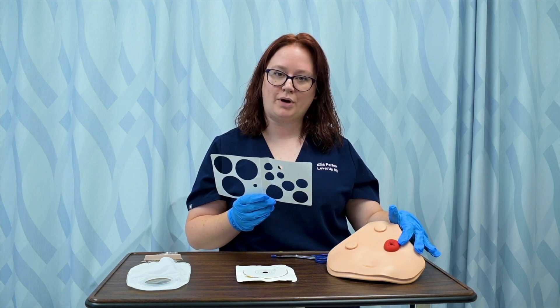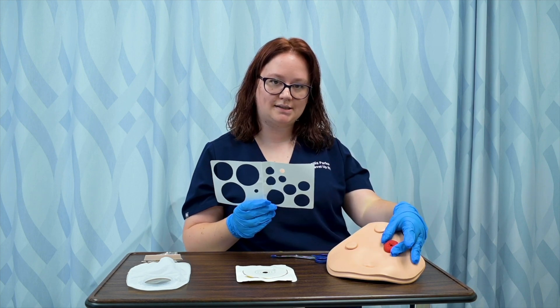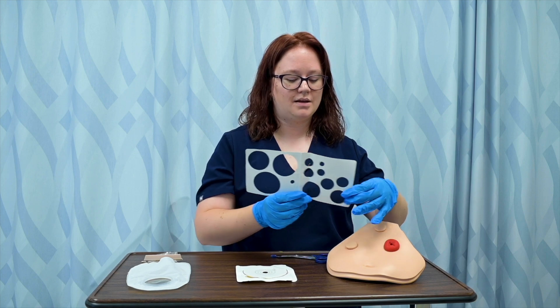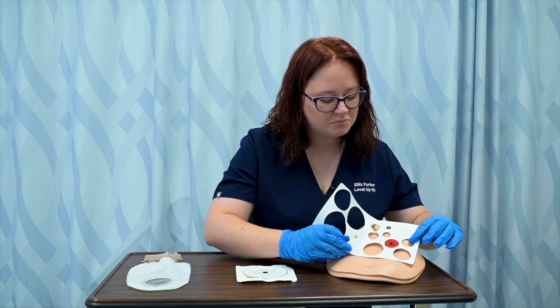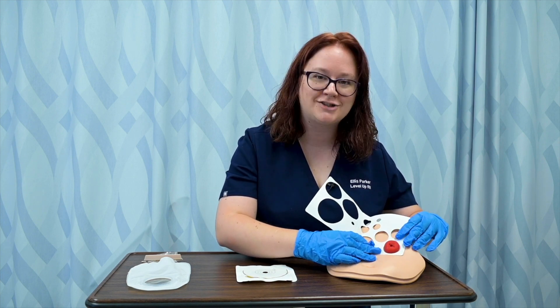I want my wafer to fit snugly against the ostomy so that no leakage occurs and the peristomal area doesn't get breakdown, but I don't want it to fit so snugly that it constricts the ostomy and prevents things like blood flow from happening. So I'm going to try a couple of different options. That one looks a bit too large, that one's a little too small — I feel like Goldilocks — but that's just right.